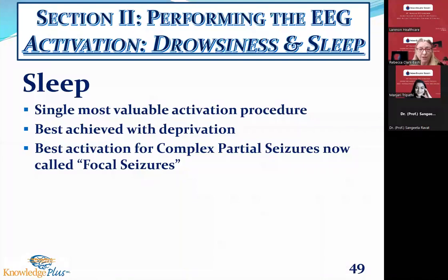Now, once inside my room, as I'm getting ready, I explain everything that's going to happen, the deep breathing exercise, the flashing lights. And the last thing I say is after the deep breathing exercise, after about 3 minutes, I'm going to come and help you get into a position of sleep. I don't know about y'all, but I don't sleep lying on my back like this. I don't. I sleep on my left side, cuddled up like this. If I am not in that position, I tend not to go to sleep. And for a lot of our patients that have apnea, even if it's not significant, they're going to be on their back where you left them, and they're going to kind of fall asleep, and all of a sudden they can't breathe and they're waking up.